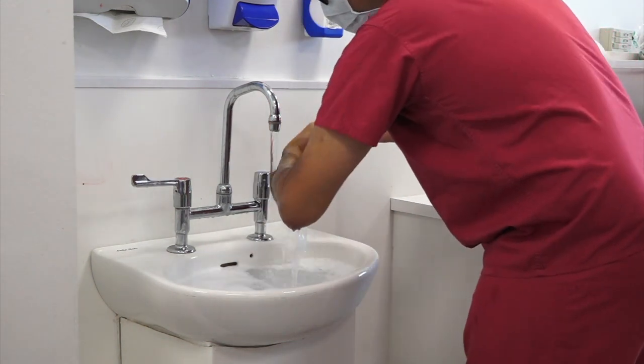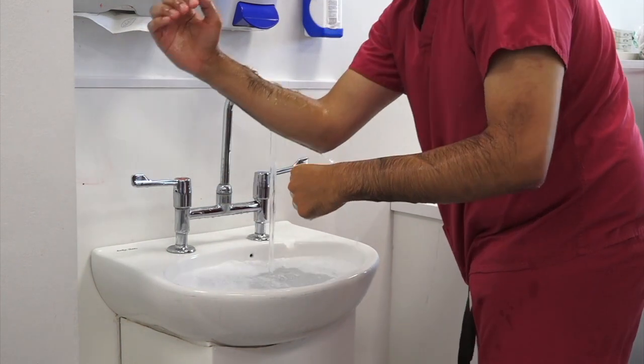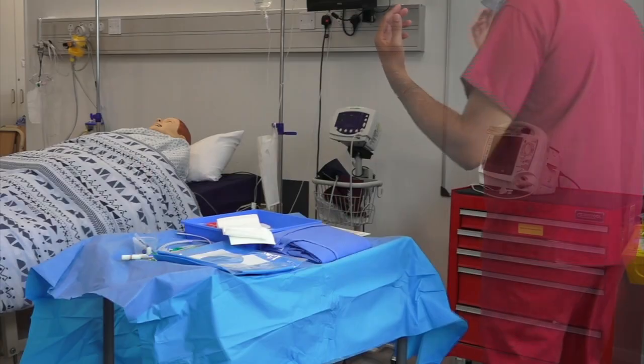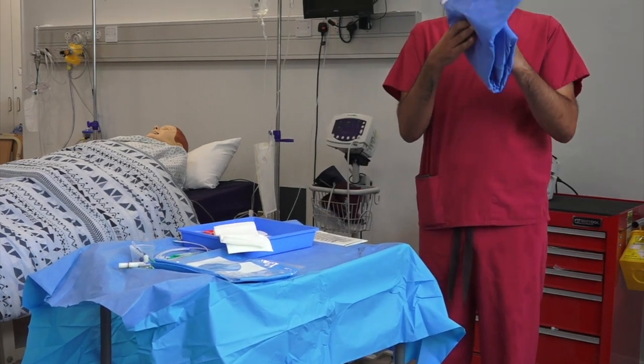Continue the scrub process for as long as recommended by the manufacturer of your surgical scrub soap, usually 3-5 minutes. Dry hands with a sterile towel and put on sterile gown aseptically.